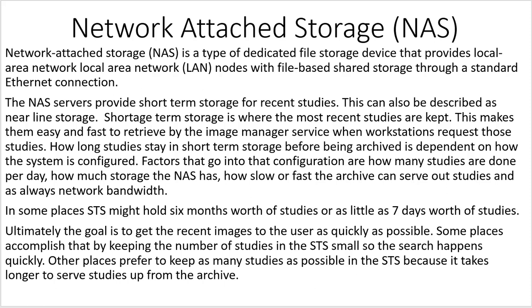Some places accomplish that by keeping the number of studies in the STS small so the search happens quickly. Other places prefer to keep as many studies as possible in the STS because it takes longer to serve up studies from the archive.